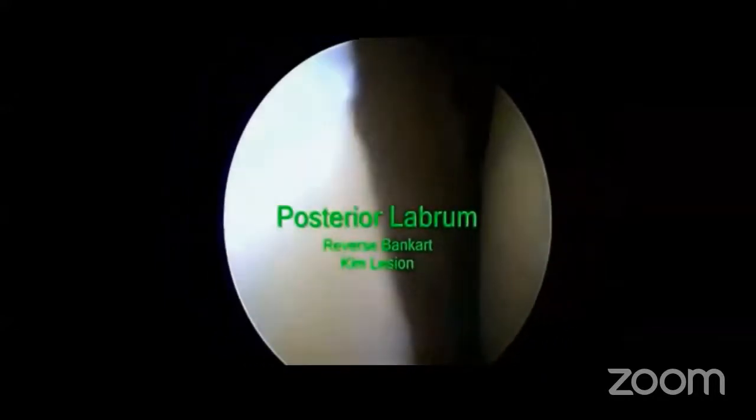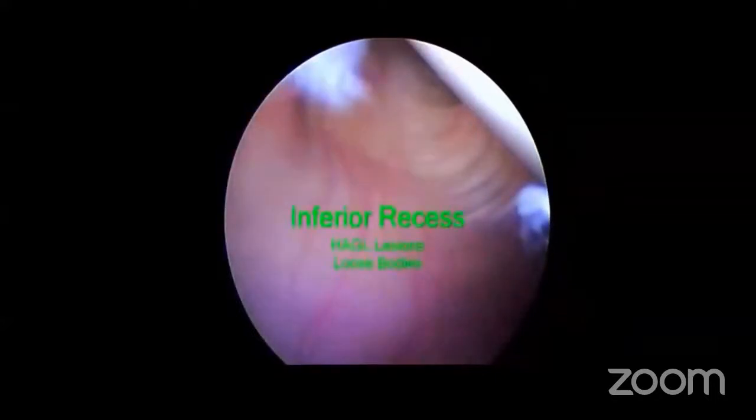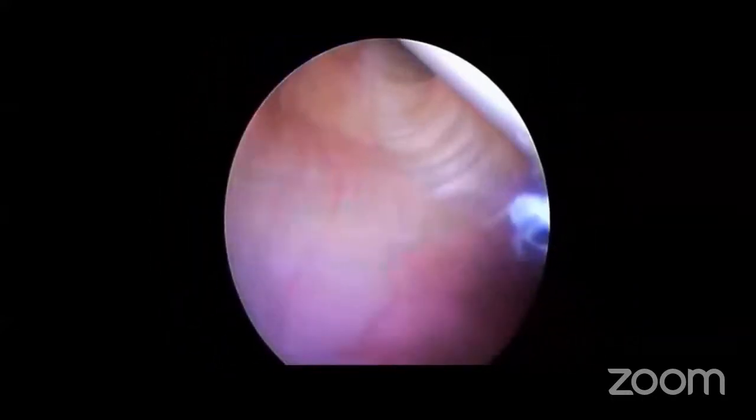Now, this is where you would observe your reverse Bankart or the Kim's lesion. This can also be observed by putting your scope into the anterior portal. Then, as you move inferiorly into the joint, you come into the inferior recess or the axillary pouch. Now, this is where you would see the HAGL lesions, humeral avulsion of the glenohumeral ligament, or any loose bodies.